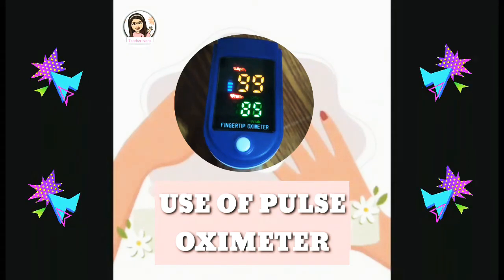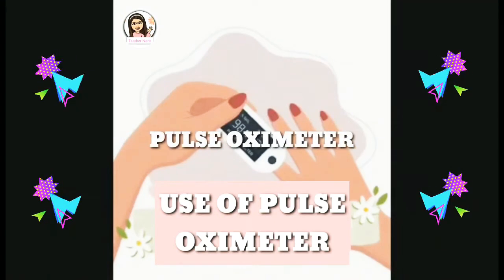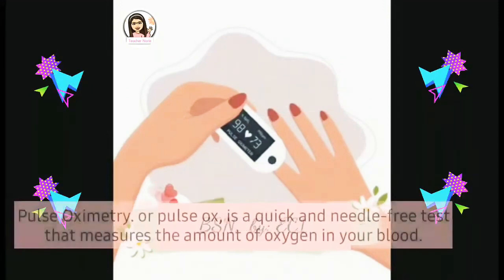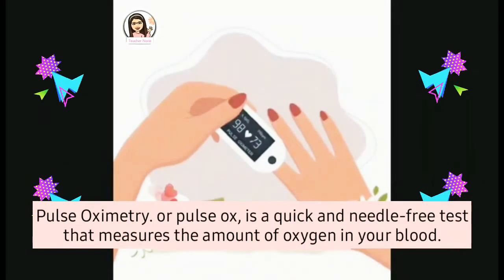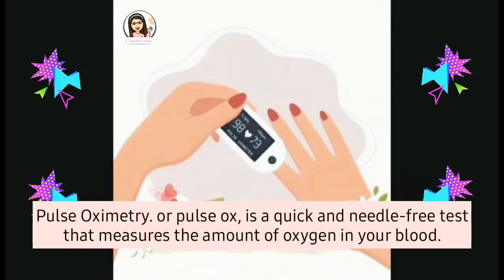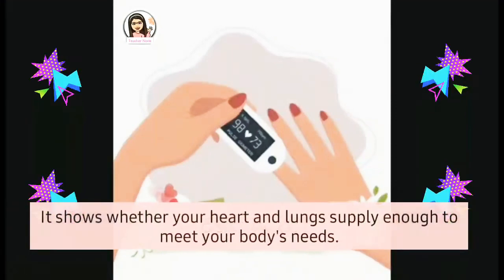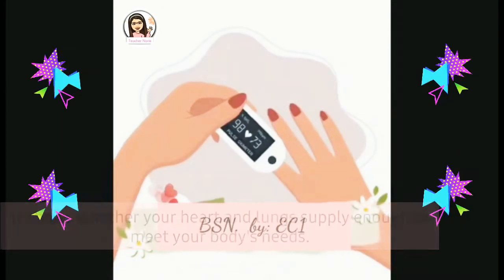In this video, we're going to learn about pulse oximetry, the pulse oximeter, and its uses. Pulse oximetry, or pulse ox, is a quick and needle-free test that measures the amount of oxygen in your blood. It shows whether your heart and lungs supply enough to meet your body's needs.